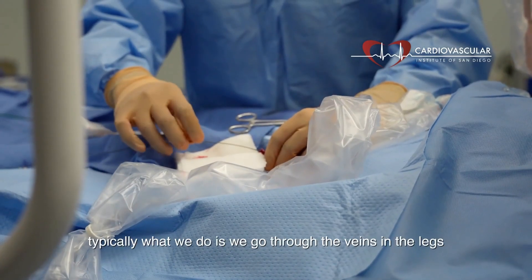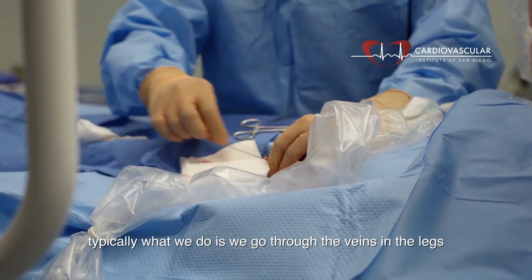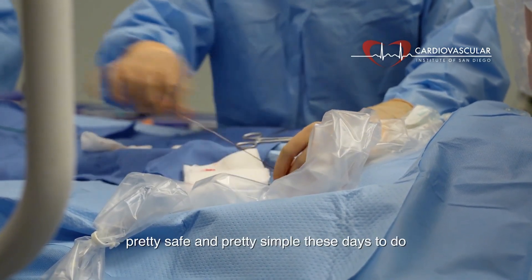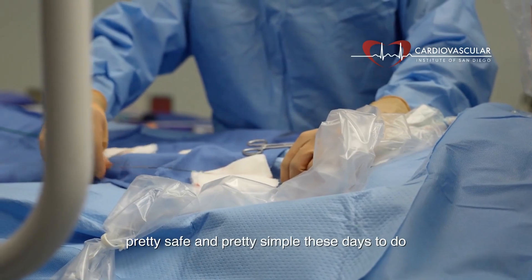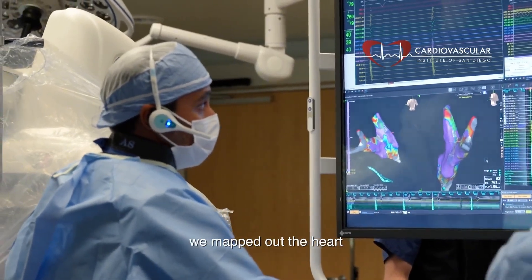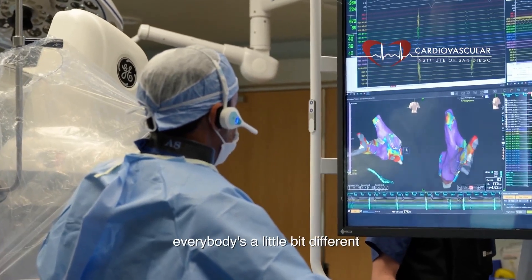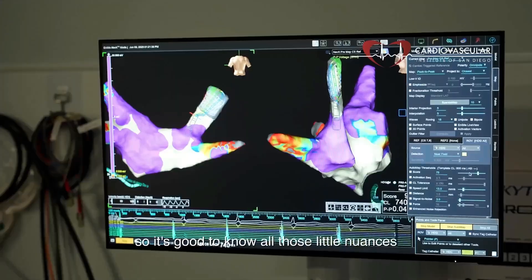During the procedure, typically what we do is we go through the veins in the legs and put our catheters all the way up into the heart — pretty safe and simple these days. Then we mapped out the heart, made a full anatomy and geometry of the heart. Everybody's a little bit different, so it's good to know all those little nuances.